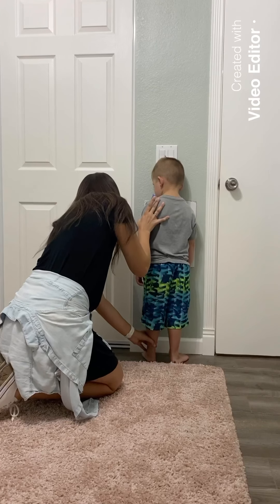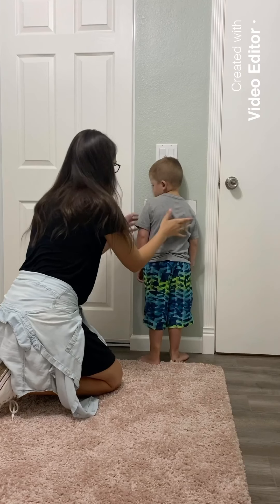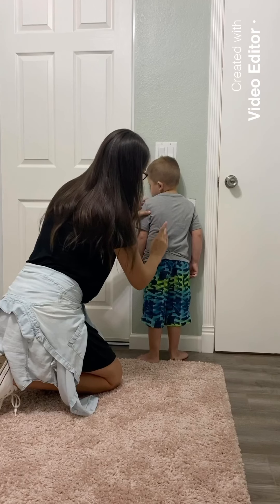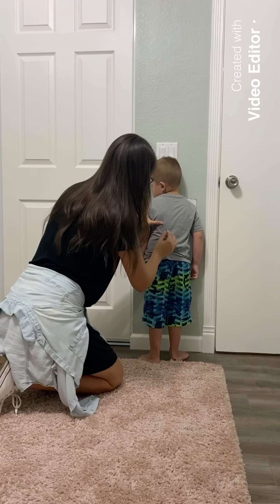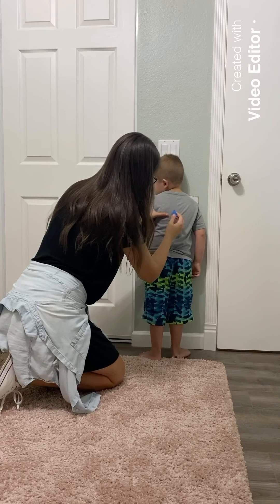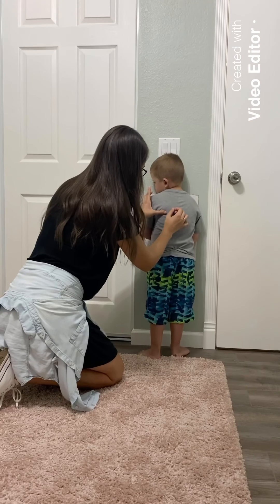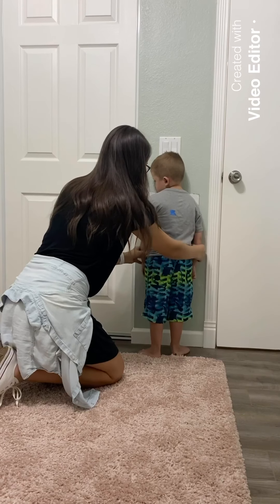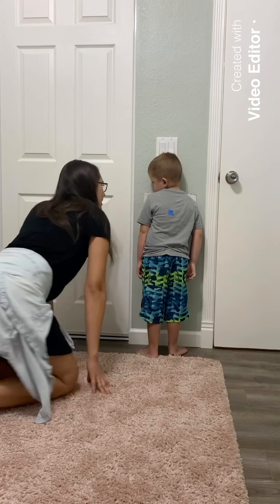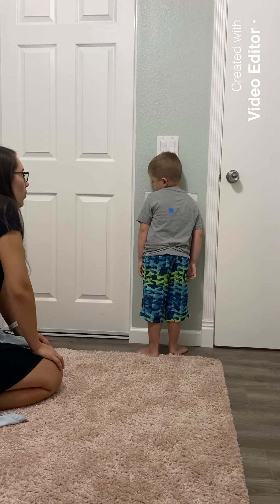Pull your foot back a little bit. That's good. You okay? Okay. And then I'm going to center on the elevated side, an inch lateral to the mid-sagittal plane on the T7. Keep your arms down. Look super still, okay? Ready? Take a big, big breath in. Go all the way out. And hold it.